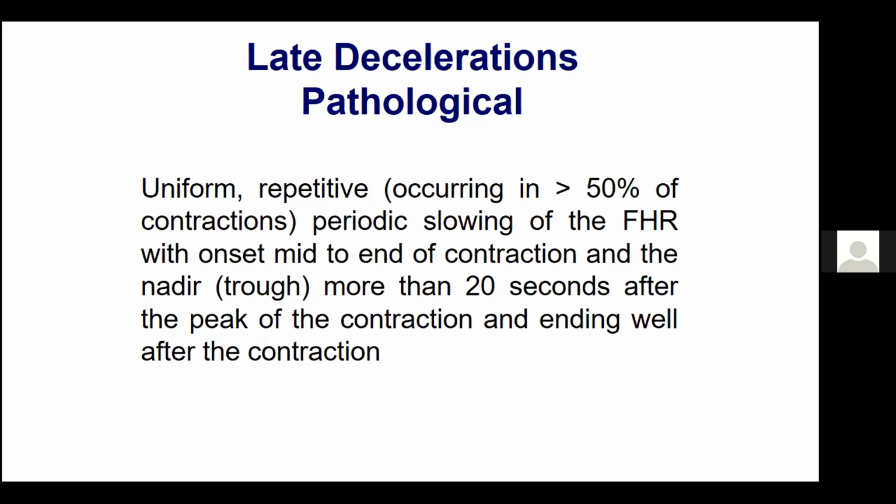So remember, we talked about early decelerations, which are normal. They tend to be physiological as long as the heart rate doesn't drop too low. Then we talked about variable decelerations, where we said that it will be an early deceleration associated with a reduced heart rate, or it will be an early deceleration where the heart rate drops by more than 45. It drops quite significantly when there is a contraction. Then now we talked about the single prolonged decel, okay, which is dangerous. If it lasts more than 5 minutes, that episode could possibly kill the baby. Therefore, it's very important that if these last more than 3 minutes, we need to consider whether we are delivering that baby. That is a pathological feature.